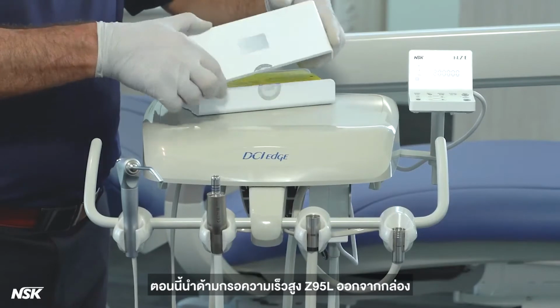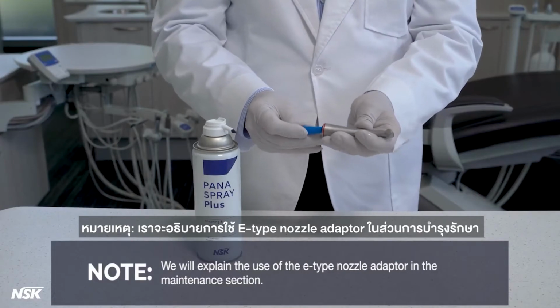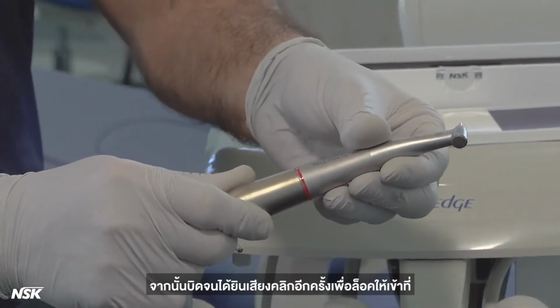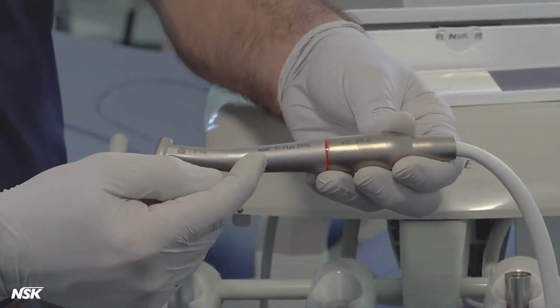Now, take the Z95L high-speed attachment out of the box. Note, we will explain the use of the E-type nozzle adapter in the maintenance section. Connect the attachment to the motor. Insert it until you hear a click. Then twist until you hear another click to lock in place. Markings on the motor and the attachment should line up.